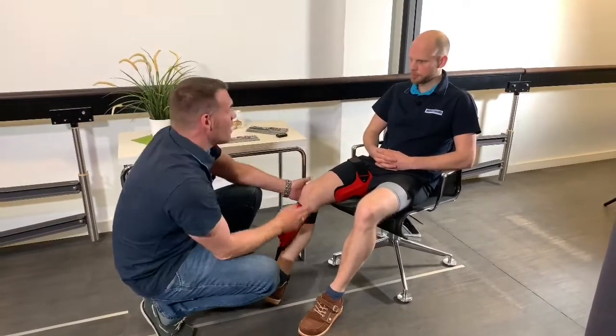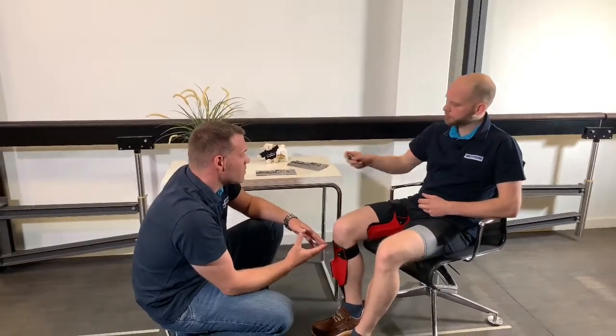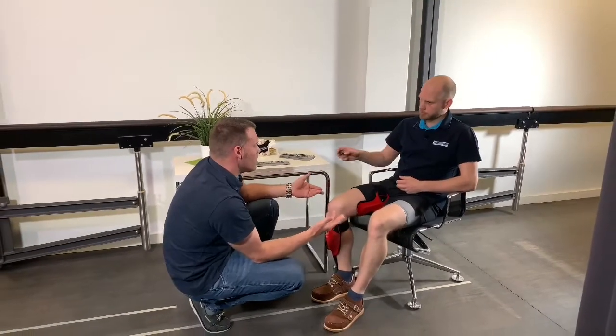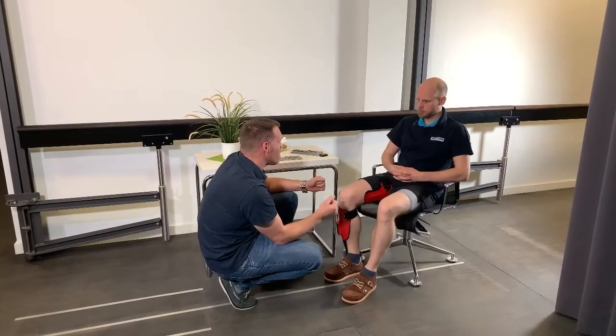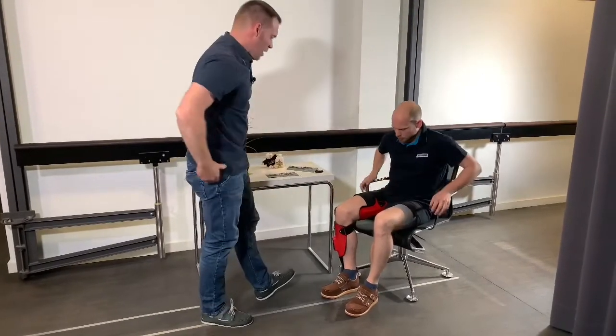Okay, David, very important. When you get up in a minute, please do not start walking immediately. We want to first check if the orthosis is correctly adjusted while you're standing, or if we need to make fine adjustments. Please switch the orthosis to lock mode for now. When you get up, you will hear a soft rattling sound — this is the ratcheting of the tooth ring inside the joint, which secures you from the first moment and prevents you from falling back into flexion. Then you can stand up carefully.